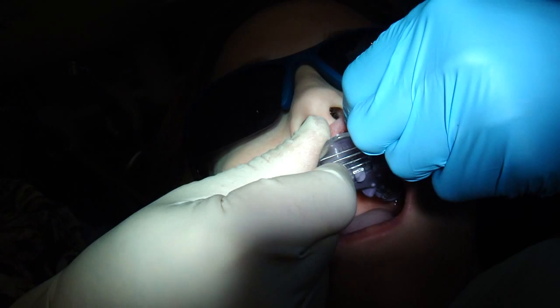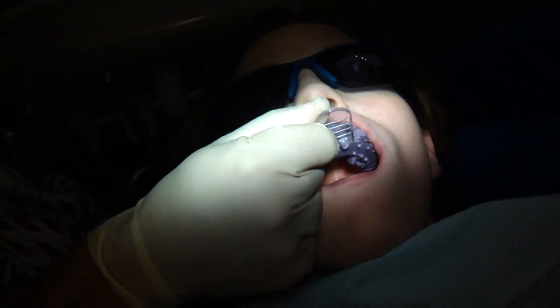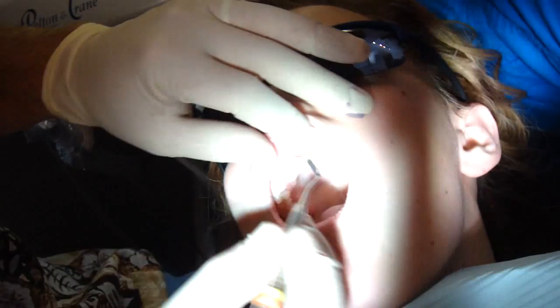Got it. I'll pull her lip up over there. Okay, that's good. About five minutes like that. All right, so I have finished preparing the teeth.